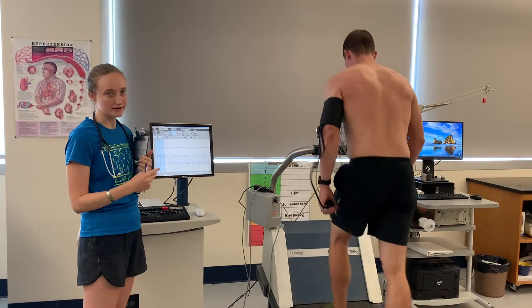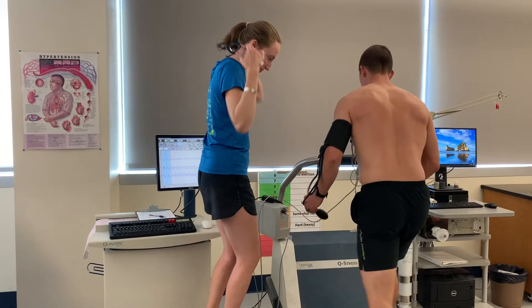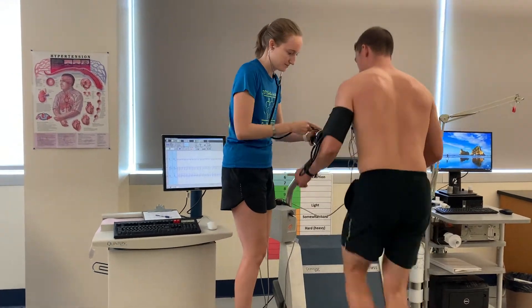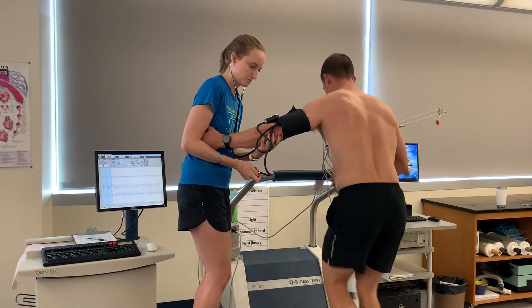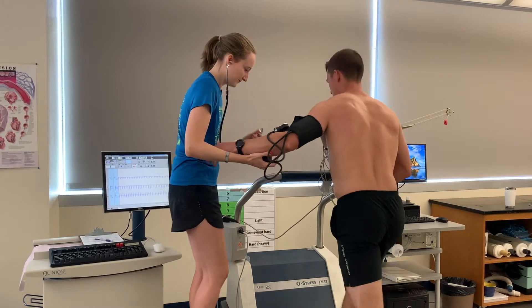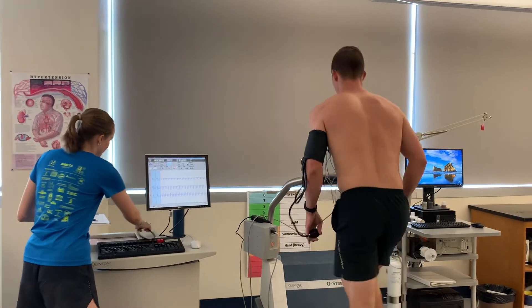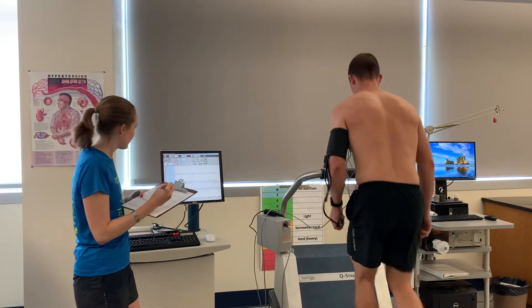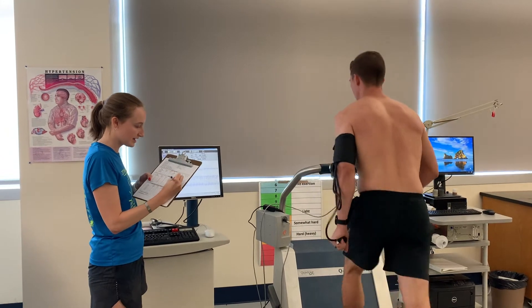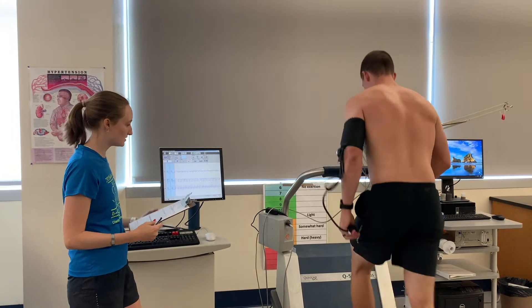We are now at stage three, and we are two minutes in. I'm going to go ahead and take the blood pressure. We are at 168 over 84, and heart rate is at 123. What's your RPE? Eleven. In about three seconds, you're going to go up to stage four. Doing really good.